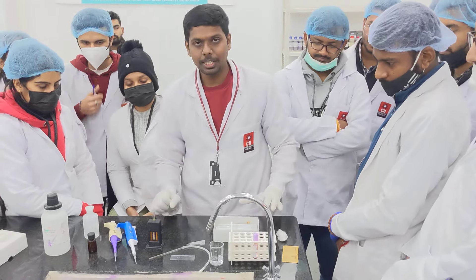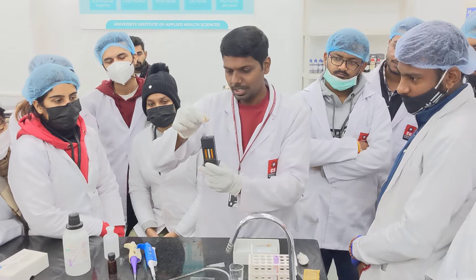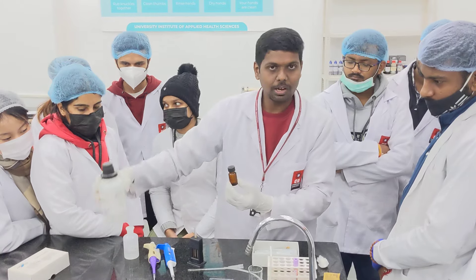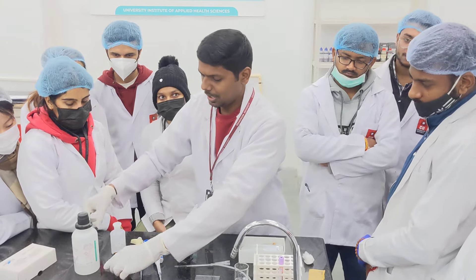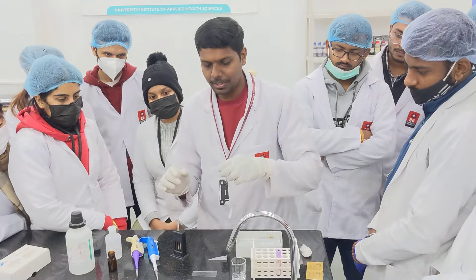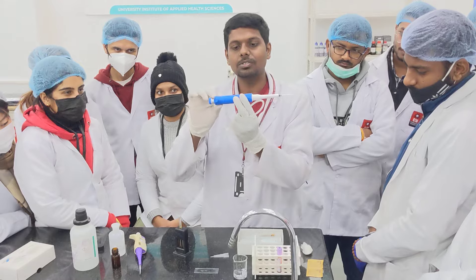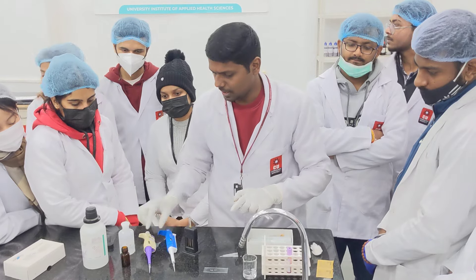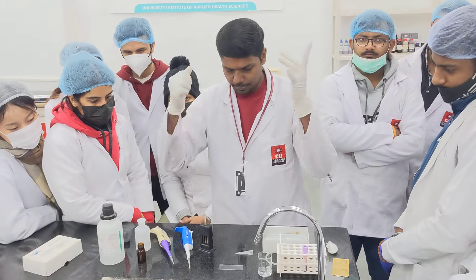Today we are performing HB estimation by Sahli's method. The apparatus required are the Sahli comparator, HB pipette, HB micro pipette, and N/10 HCl. We have a stock N/10 HCl and have also taken N/10 HCl in this amber bottle. We need distilled water as well. Rather than encouraging mouth pipetting, we are using a micro pipette already calibrated at 20 microliters. I have another pipette for drawing N/10 HCl.